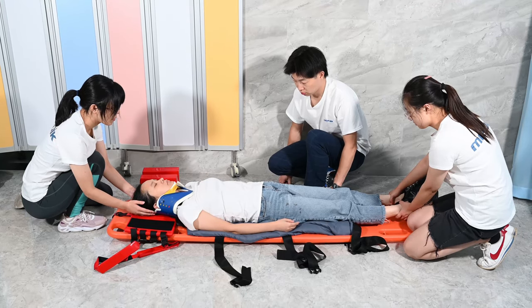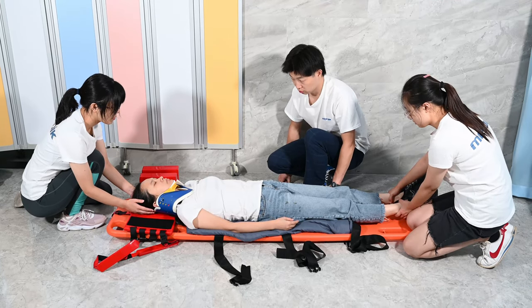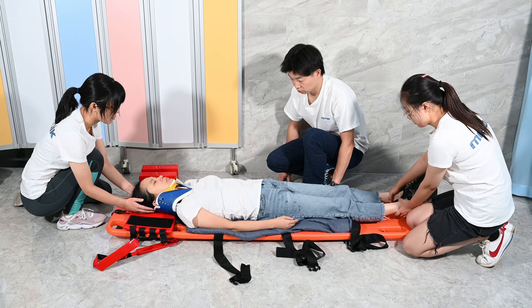Alright, right now we are going to fix the head and finish all straps of the patient. Then we uplift the board.